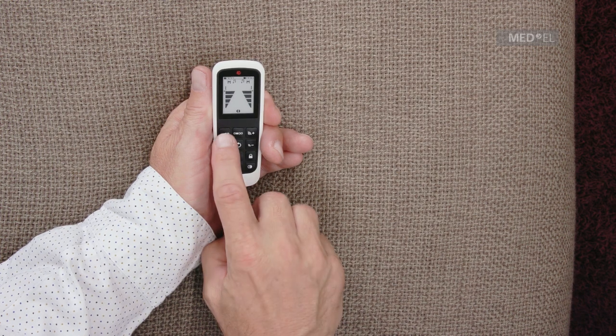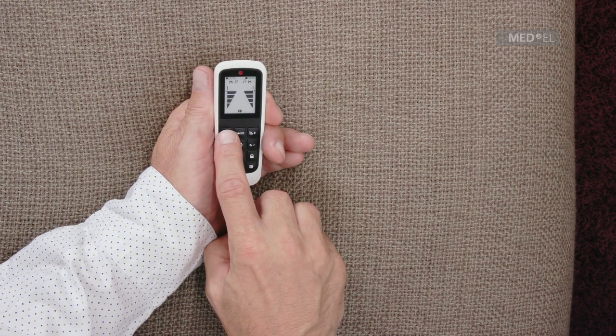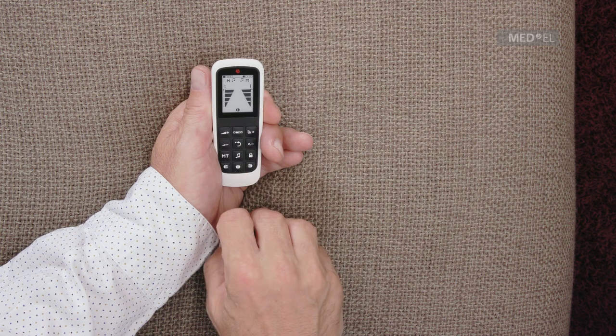To turn up the volume with the FineTuner Echo, press the upper volume key. To turn the volume down, press the lower volume key.